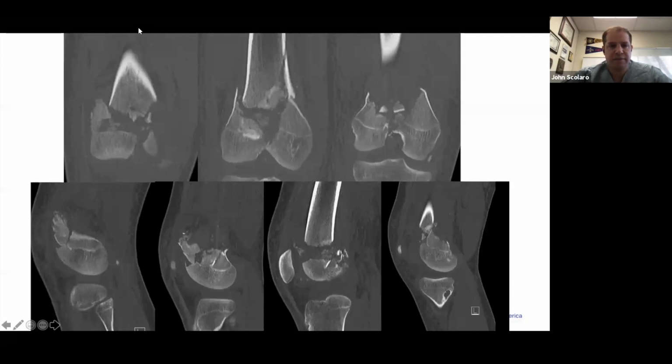And so it looks like there's metaphyseal impaction. There's a cortical piece on the medial side there. It looks like, I believe on the top images, that cortical fragment is on the medial side. So if I'm going to go over to the medial side and disrupt the biology there, I want to make sure it's for a reason, and that it's a read that I'm not going to have on the lateral side. If not, I can probably utilize just some sort of lateral parapatellar for the whole injury.